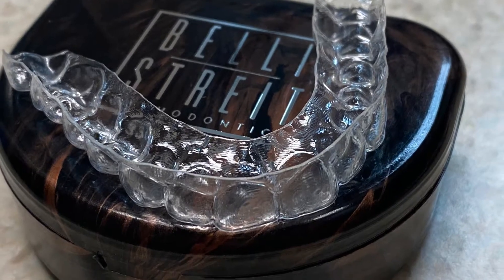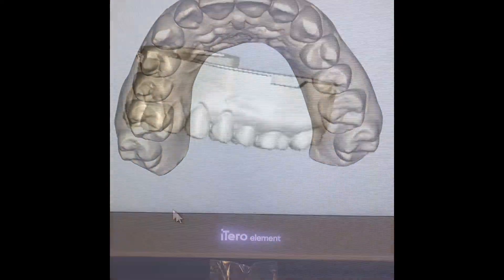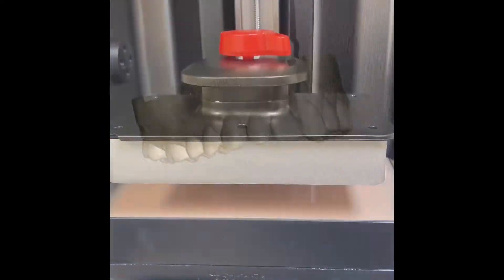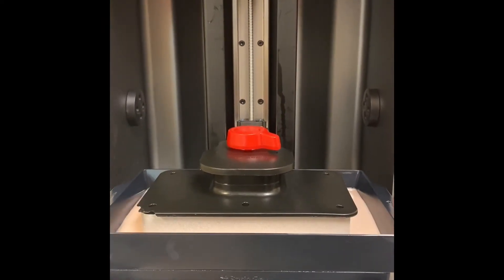How is your retainer made from digital model to your mouth? After your scan, we have a digital model that is then sent to our 3D printer. With our Sprint Ray printer, we can print six models in 90 minutes.